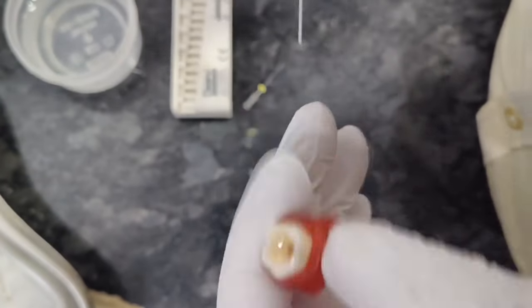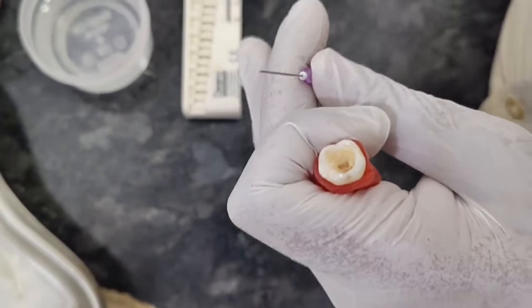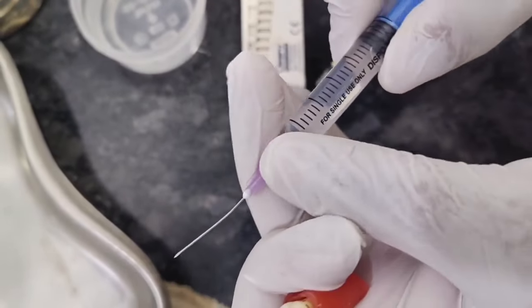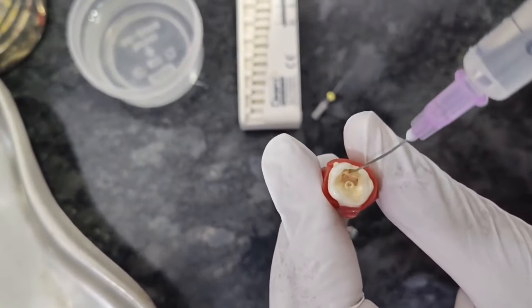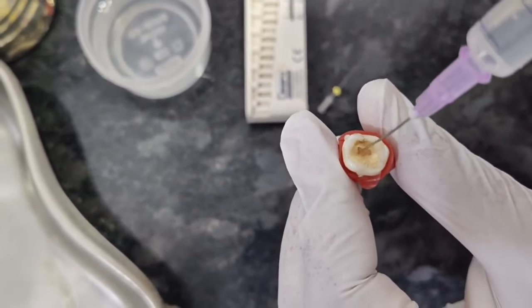Then again, you have to irrigate it with saline, or what I use is sodium hypochlorite. So this is the sodium hypochlorite solution I have already kept. I usually use sodium hypochlorite solution initially, so that all the canal debris and all the canal nerves will come out with all the infected blood and tissues.